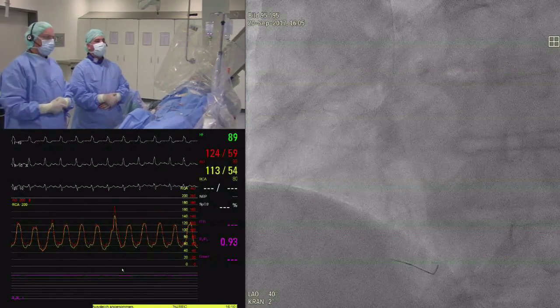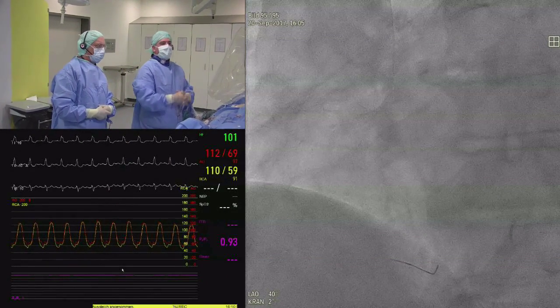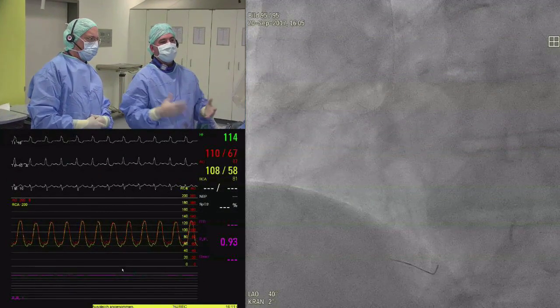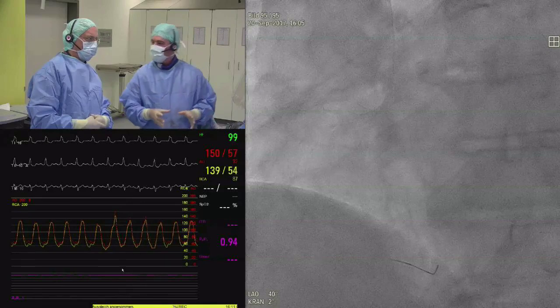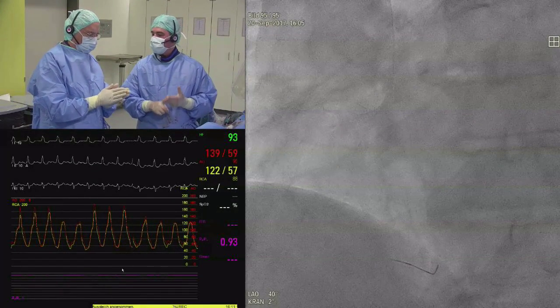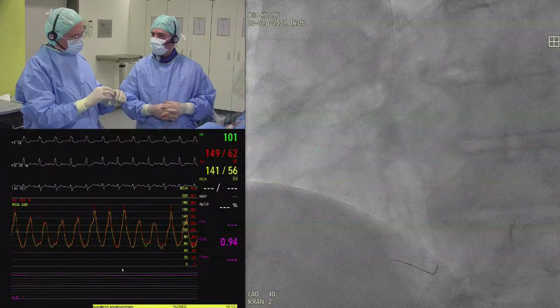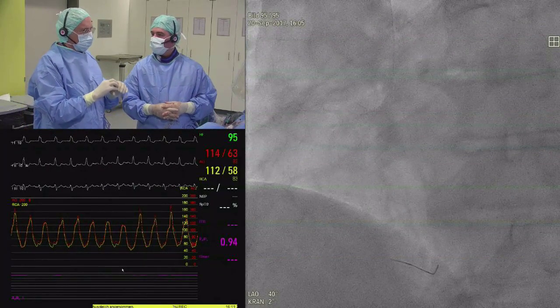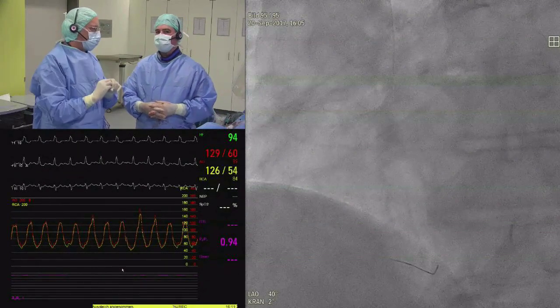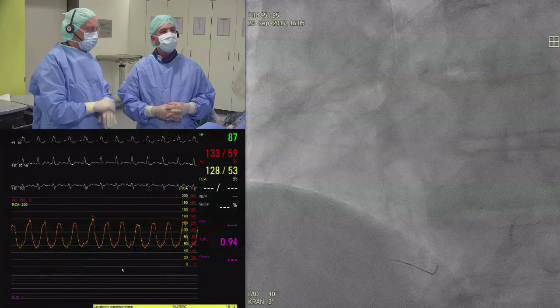I mean, just in case. I mean, those are the check boxes you have to... No, you're absolutely right. You have to assure when you're doing these type of things, so to be accurate. And I think one of the most important things, at least in my experience, is to play a little bit with your setup to really make sure before you do the measurement that your guide is in the right position, that you have a very nice equalizing of the wire, and that what you measured makes sense at the end of the day, right? And if your guide is sucked in a little bit, that's going to give you falsely normal readings, or may fool you into thinking that the lesion is not significant where it may actually be if you'd had a good guide position. So that's why it's important to play with that.